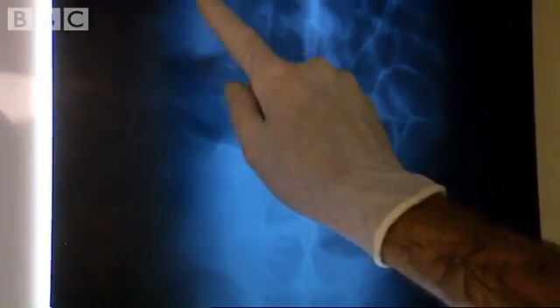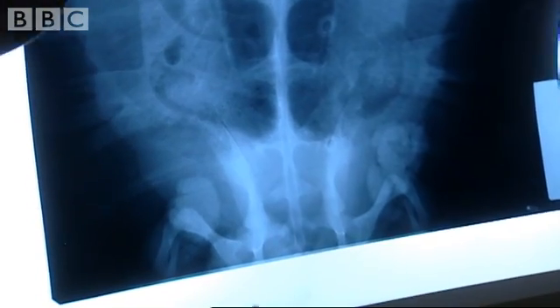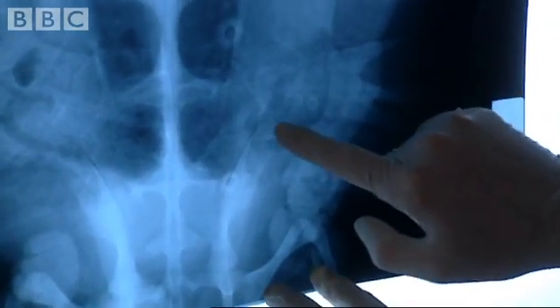See all of these nodules? Those are all tumours. So this one — when I say it looks clean — she looks relatively very clean inside, except for these two little spots. So I'd rather Doug look at those and let's see what he thinks.